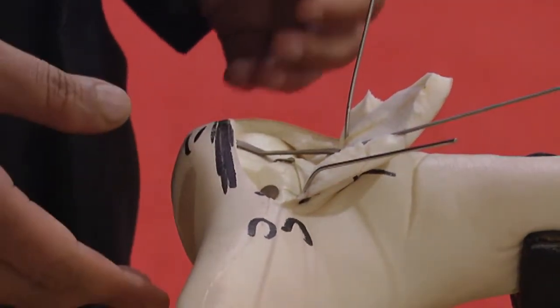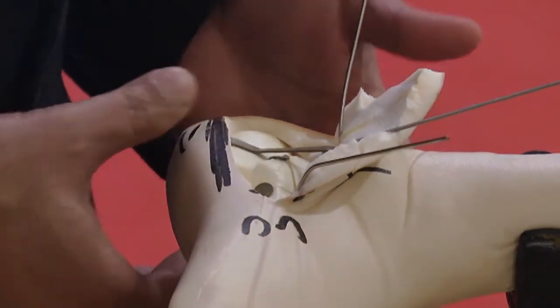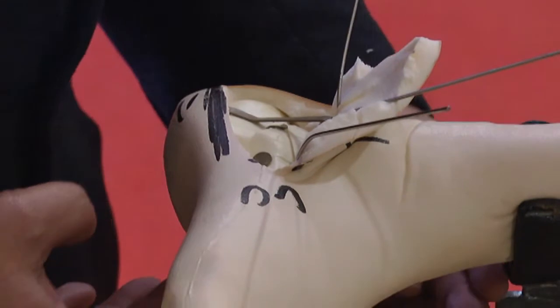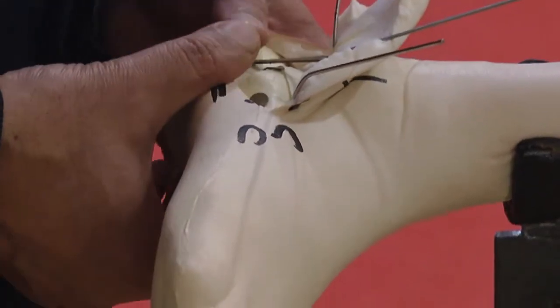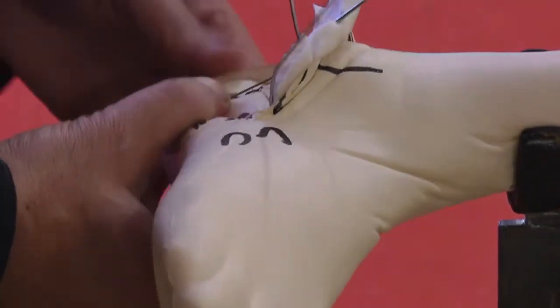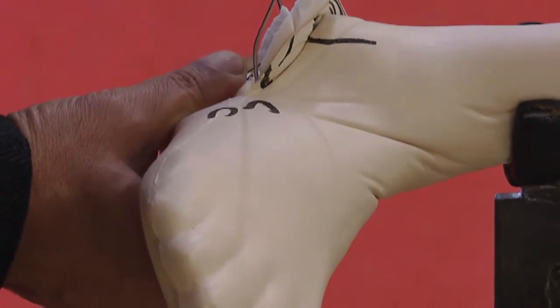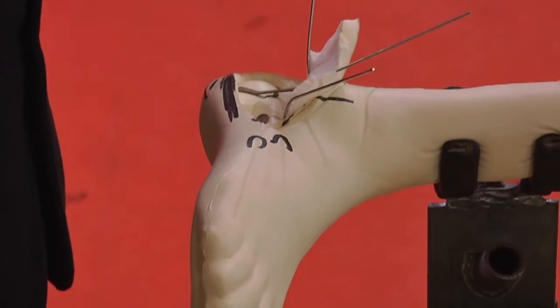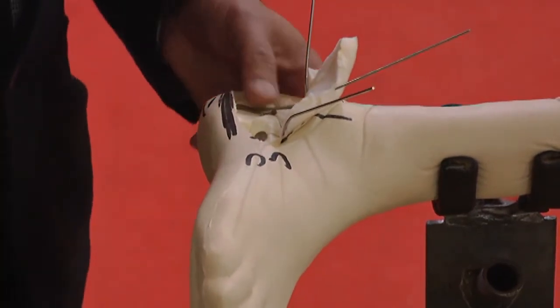Now, at this point, if you want to look inside, you have a bump in place here. That bump is moved onto the leg, the heel is now free. And if you do this maneuver on the table, you see directly into the subtalar joint. There's a lot of clot there. Need to remove that clot, wash it out to see the joint surface.